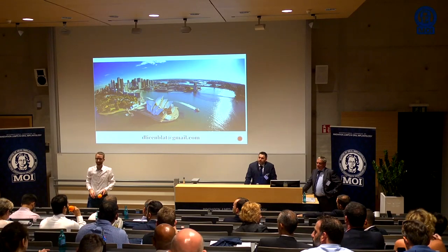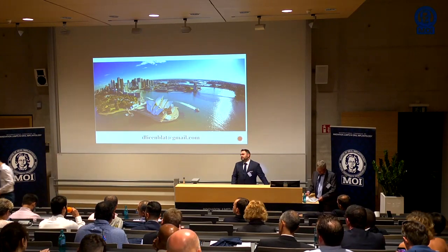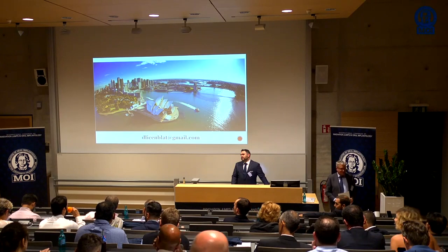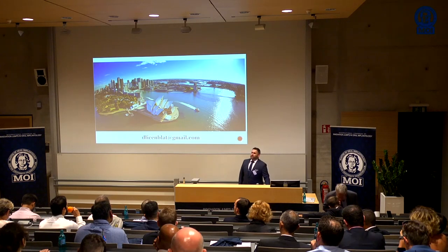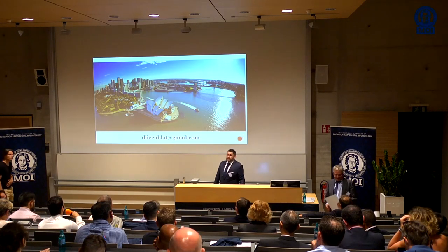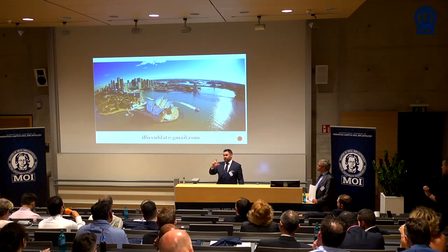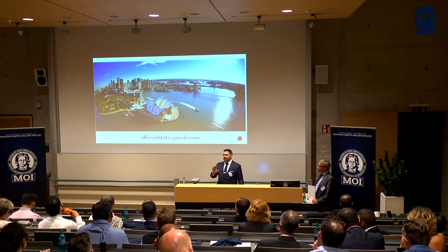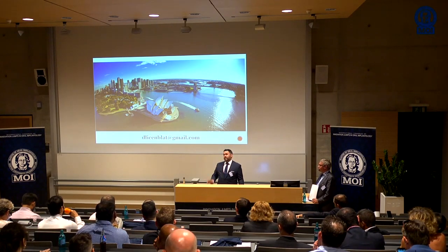Very nice presentation, I must say. Just a little question. You mentioned in one slide that the average was D2 bone. How did you calculate the bone density? What I did is I took the cone beam, and for the implant, it gives you an opportunity to have a look at the bone quality. So it is a rough estimate at best. Without doing a medical CT, it is impossible to really determine the quality.